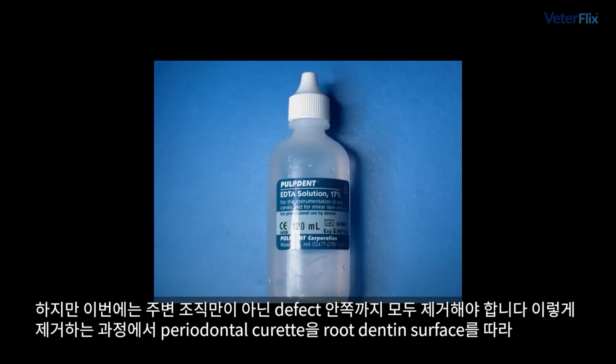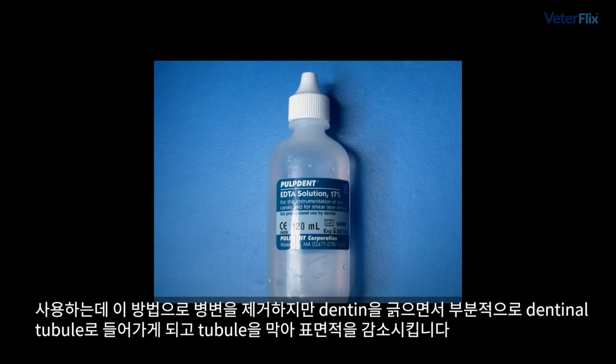So once that's removed, what we've done by using that periodontal curette against that root dentin surface that's pretty profound as far as volume of surface area goes, we'd like to try to eliminate what has happened in the process. And what happens is that the dentin we're scraping away gets partially injected into those dental tubules and blocks them and decreases the surface area.